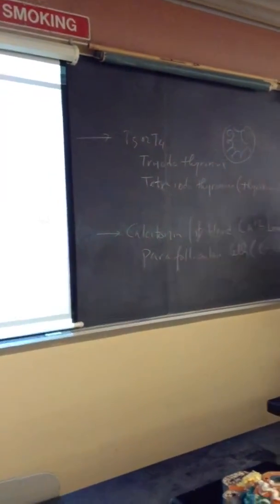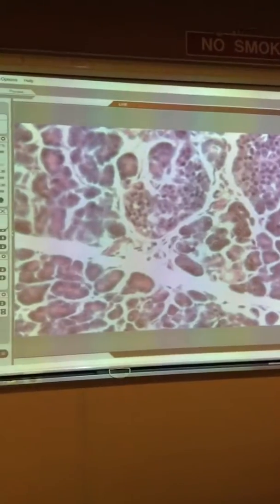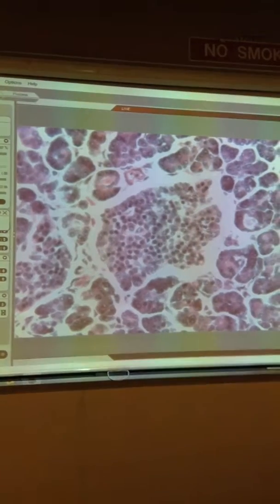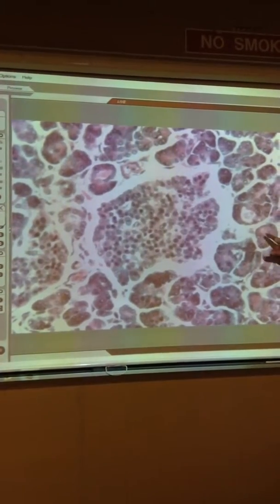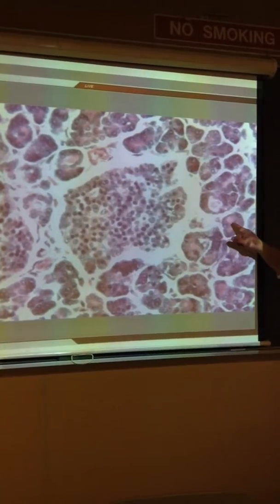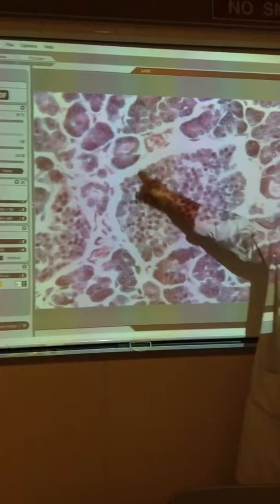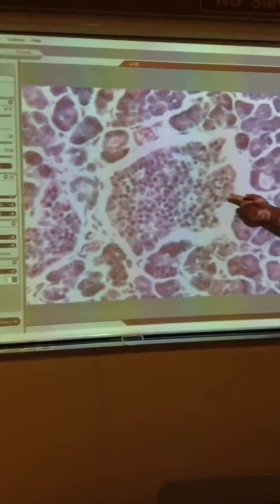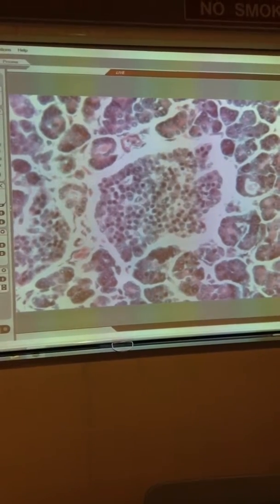As the endocrine, they're more, I'm going to zoom up that area of the Langerhans. You can see here's your typical acinar cells, okay? Lining, and they will secrete the enzyme. Here's another one. But here you don't see that structure, right? These are completely different. So we put an arrow here and ask you what is that? You say, oh, that's an islet of Langerhans, for example, right?